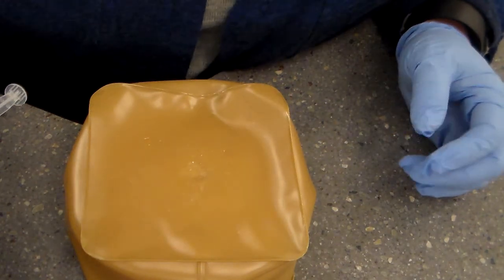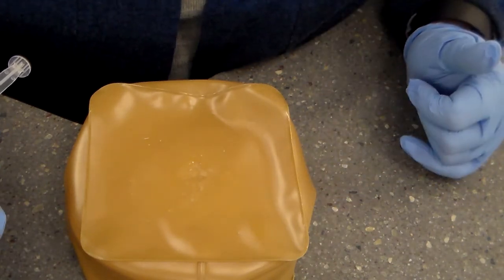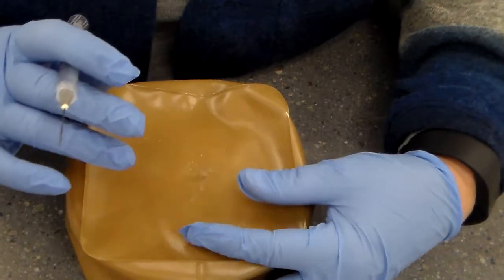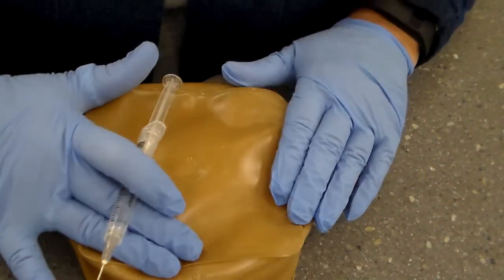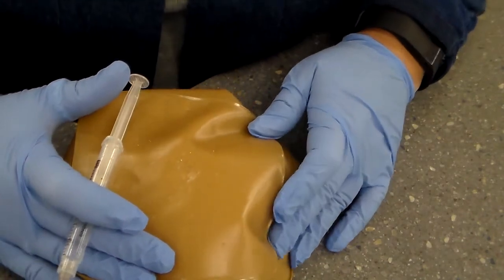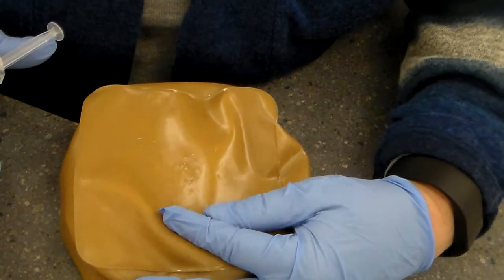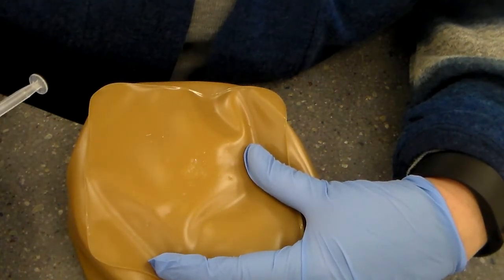Okay, so we've cleansed it with the alcohol, we've allowed it to dry, and we have our gloves on. You're going to pull the skin taut. And when I say taut, that means pull it like this. Remember before with sub-Q, we bunched it up. We don't want to do that. We want to pull the skin taut.